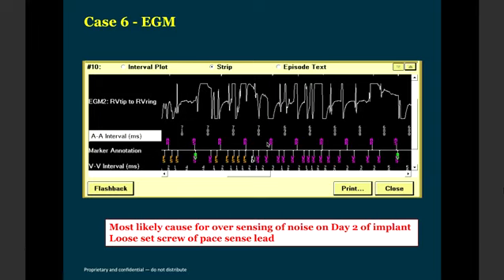Only thing, having said that, there is no study to date to prove superiority of dual chamber ICD over single chamber ICD. Nonetheless, it gives us another port of electrogram so that we can analyze the arrhythmia signals ourselves. So what went wrong can be better delineated.